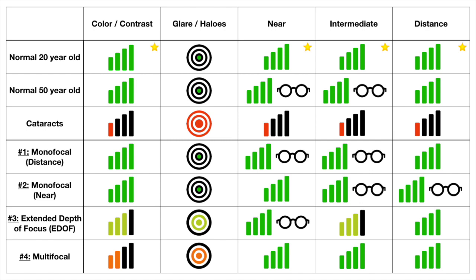Here is a picture to summarize the lens options. Thank you for your attention. Remember, any of these lens options are going to be an improvement from your vision with cataracts, so please direct any other questions to your doctor.